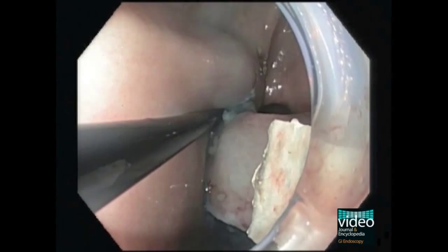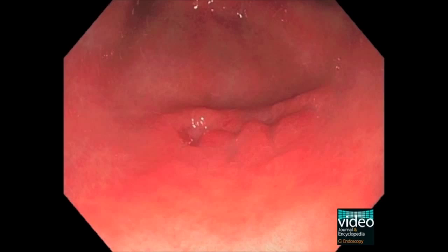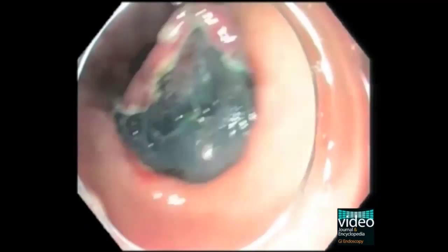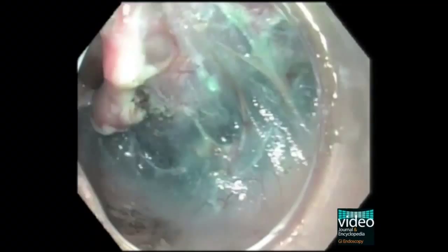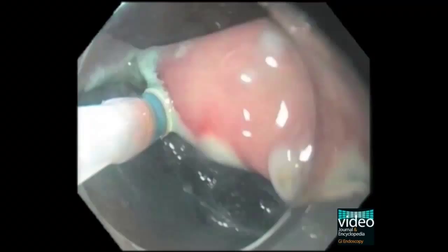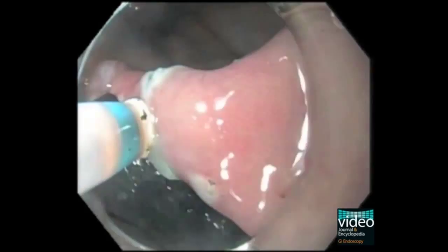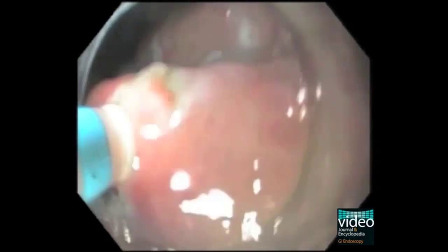In this case, a patient with a type 2A to 2C gastric lesion with high-grade dysplasia was referred for ESD resection. The localization enabled good submucosal visualization, but using the yo-yo technique and pulling the snare, the access to the submucosal space improved. Pushing the snare, the luminal side is displayed, turning ESD into a safer and faster procedure.